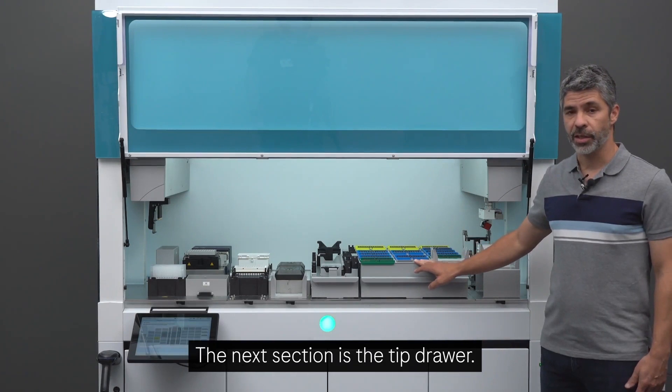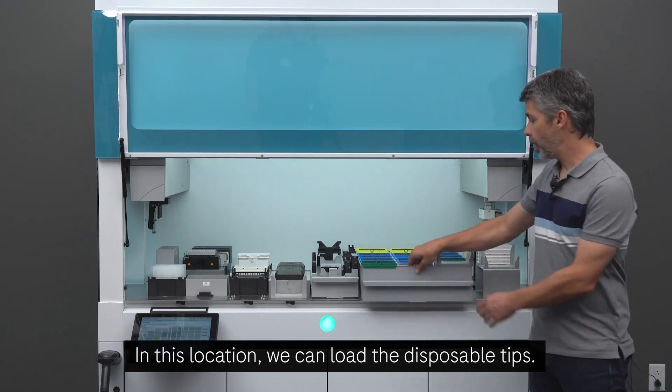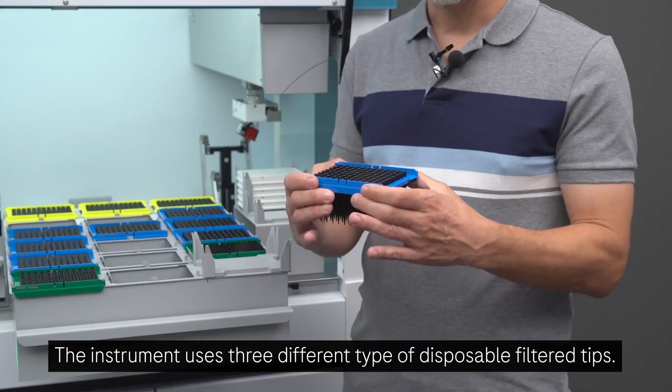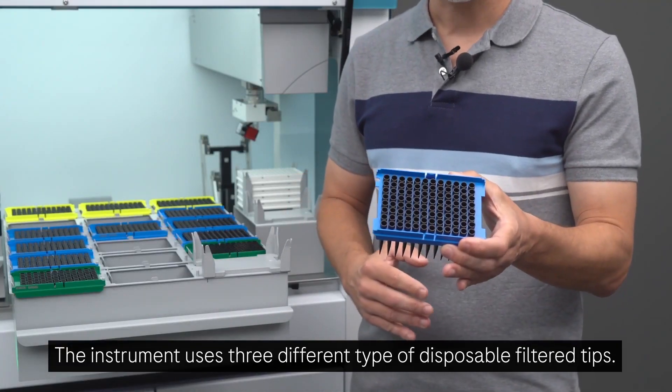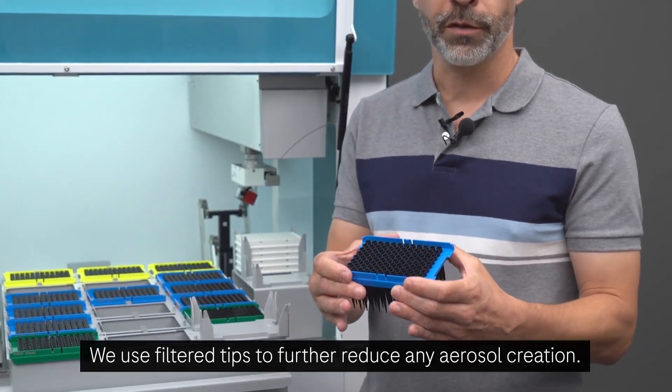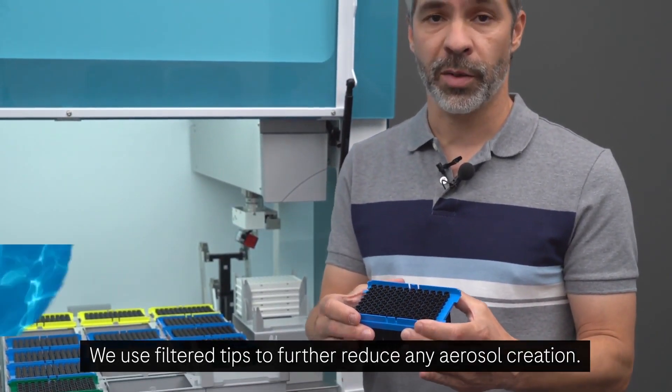The next section is the tip drawer. In this location, we can load the disposable tips. The instrument uses three different types of disposable filter tips. We use filter tips to further reduce any aerosol creation.